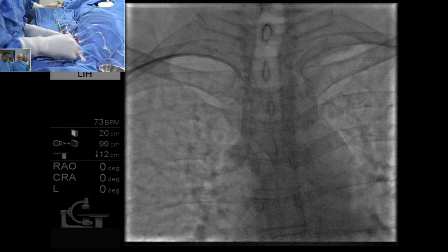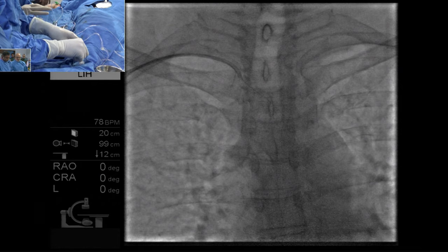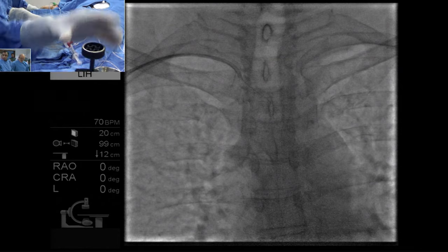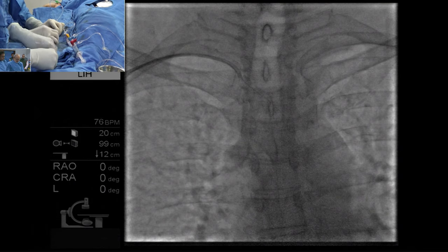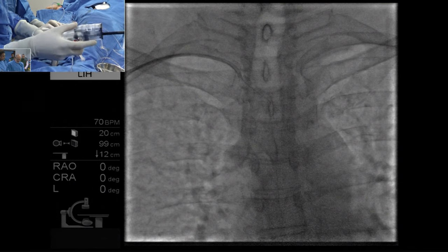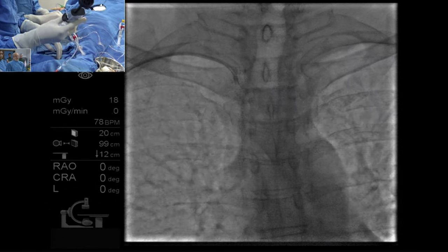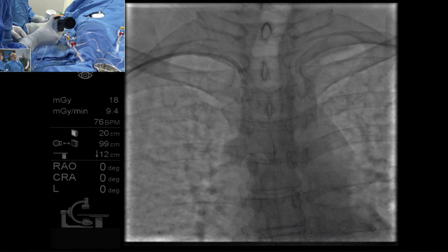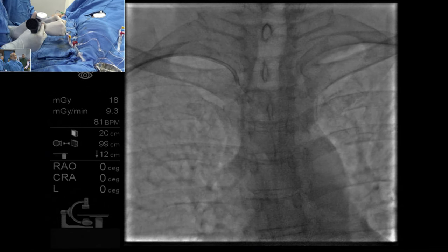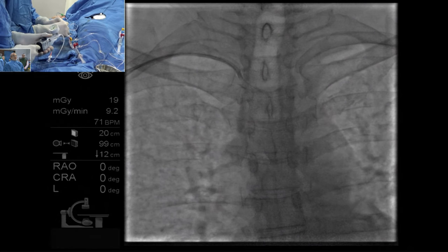But this can be demonstrated. I want to demonstrate to the young crowd that, judiciously, if you use this technology, it saves a lot of trauma in the vascular system, and it helps not only while performing the radial, but even for femoral intervention when you have extremely tortuous iliacs and other things, this technique works.